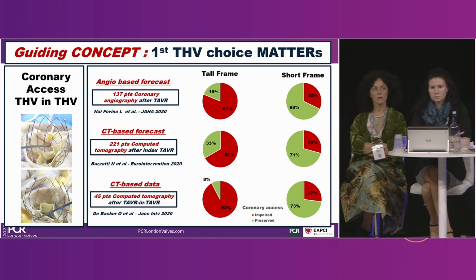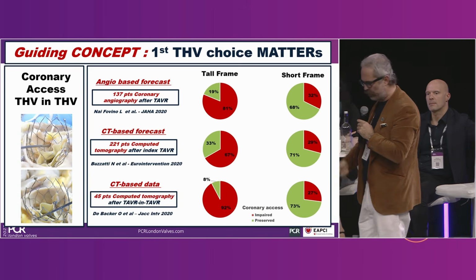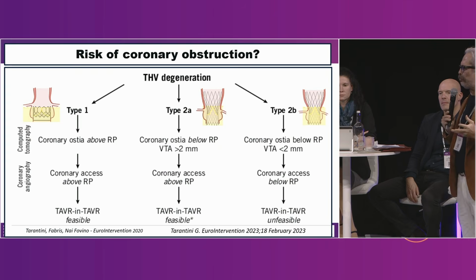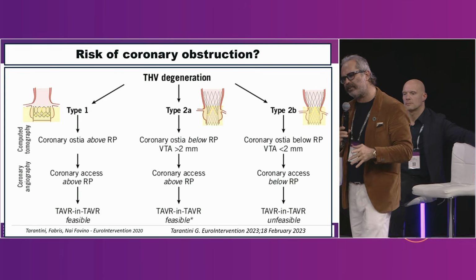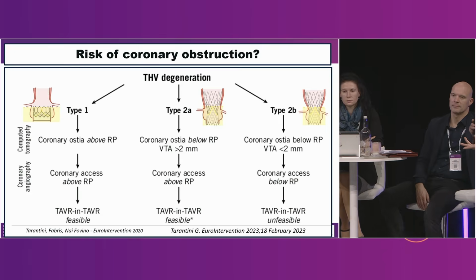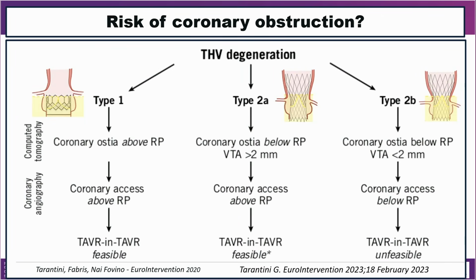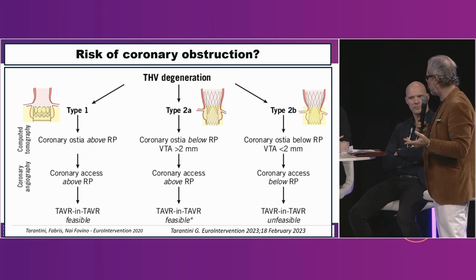On the other hand, the short frame, like the surgical valve, actually permits an easier coronary access that is impaired only in 1/3 of the cases. So, to simplify, but I think it's important to simplify our practice sometimes, we can identify 3 different types of coronary, let's say, impairment. The type 1 is when we have a short valve, like the surgical valve. You don't have anything in front of the coronary, so it's quite easy to think that when you go with a second valve, mostly if it is oriented, might be an easy access.